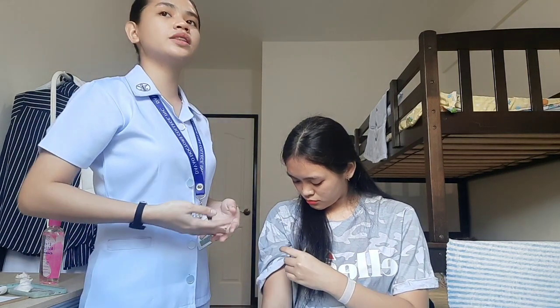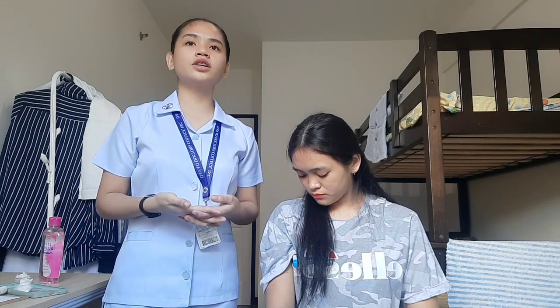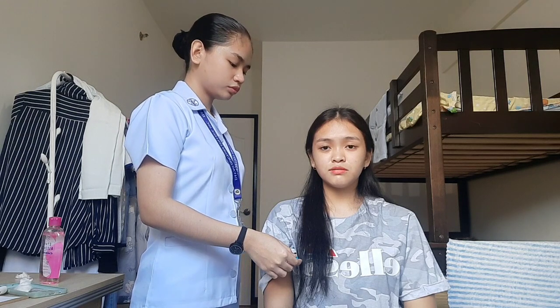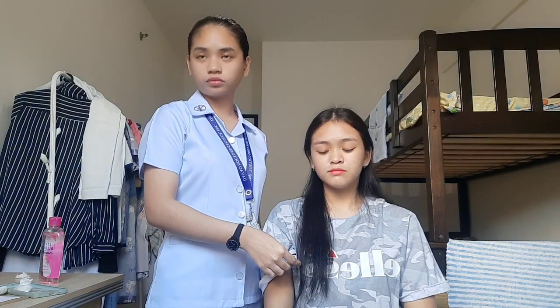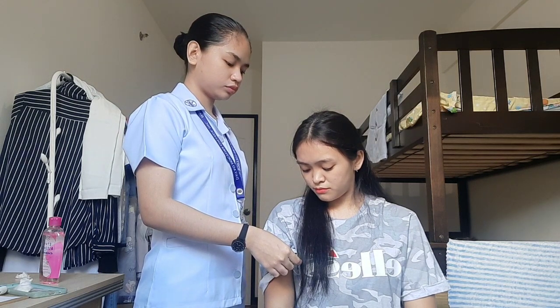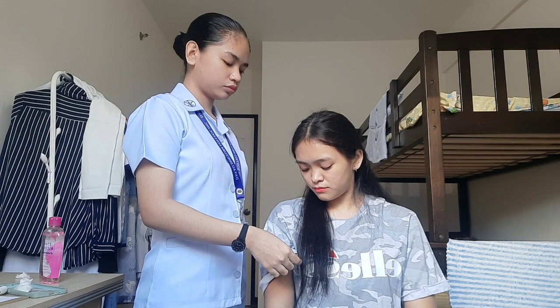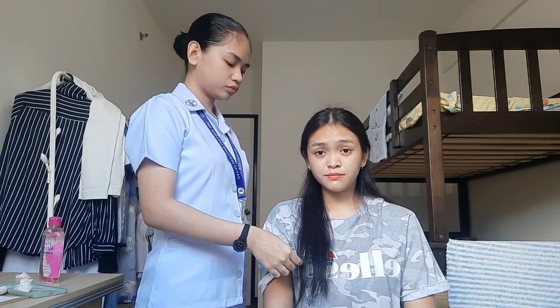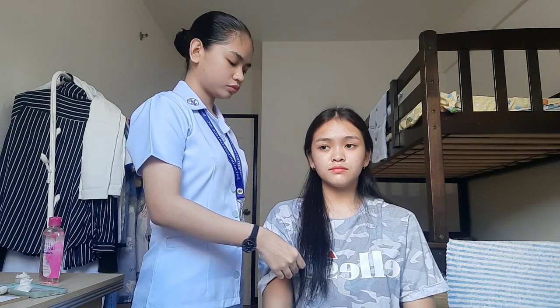Then I will leave the thermometer in place until a signal or beep is heard, allowing sufficient time for the axillary tissue to come in contact with the thermometer bulb, which results in a reasonably accurate measurement of the body temperature. Okay, ma'am. Your temperature is 36.5, which is normal.